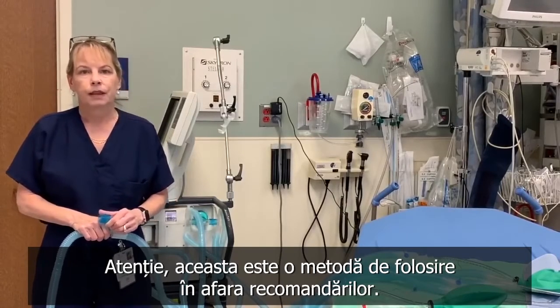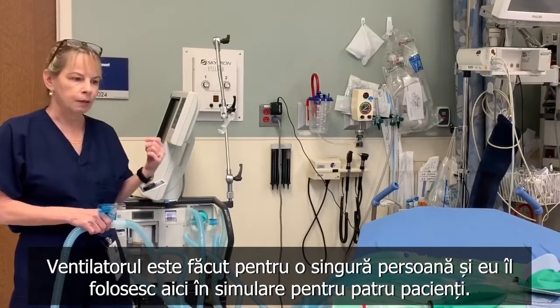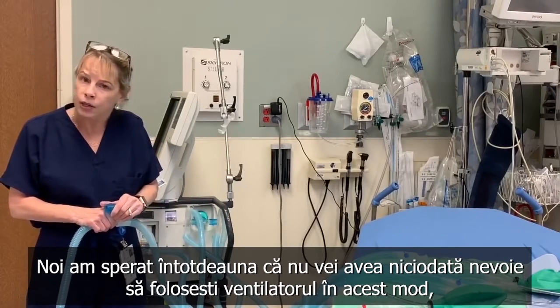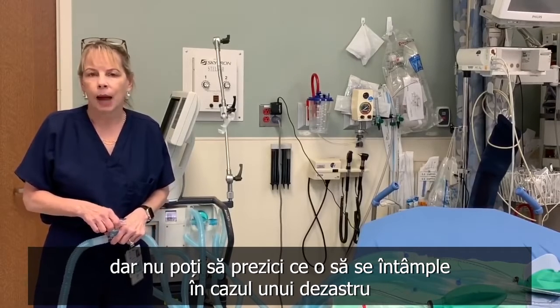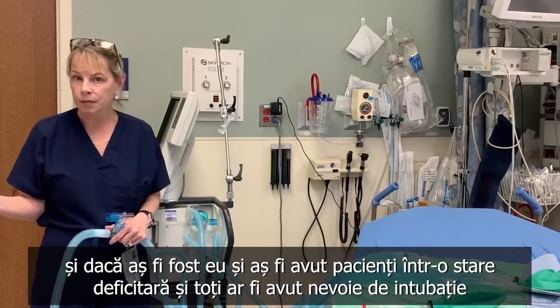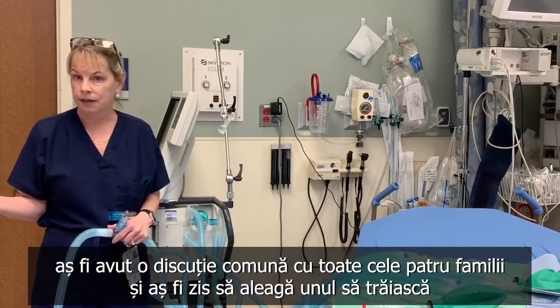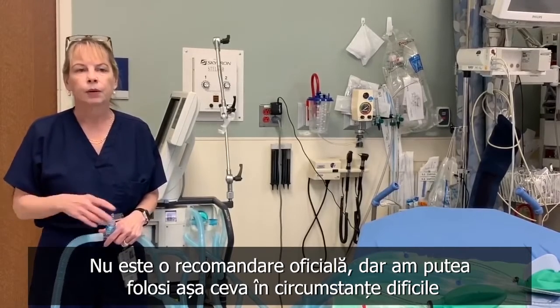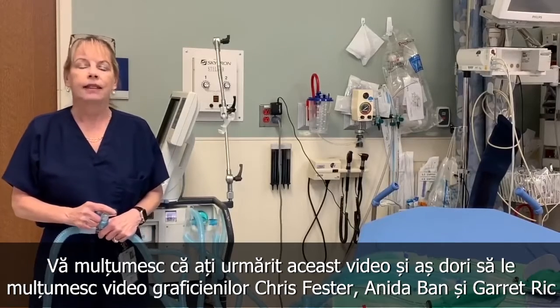Now here's my disclaimer. This is off-label use of the ventilator. The ventilator is made for one person, and I'm using it here in a simulation of 4 patients. And so I always hope that you would never need to use it in this way, but you can never predict what's going to happen in a disaster. And if it was me and I had 4 patients and they all needed intubation and I only had 1 ventilator, I would simply have a shared discussion meeting with all 4 families and say I could pick one to live, or we can try to have all 4 live. But this is clearly off-label and likely would only be used in a dire circumstance, which we may see with COVID-19.